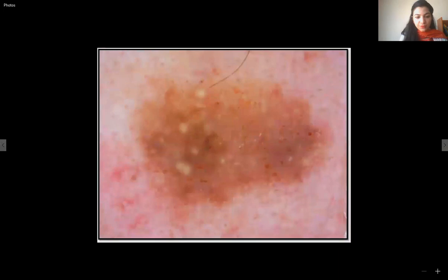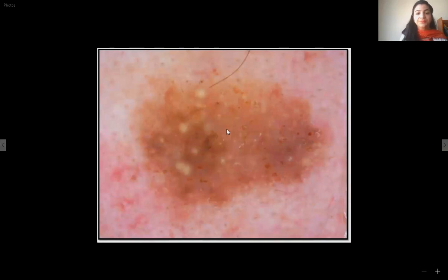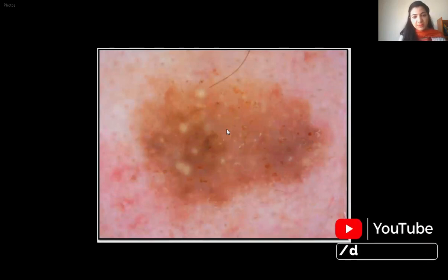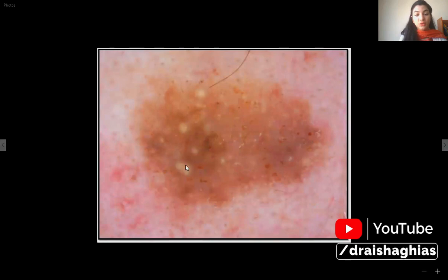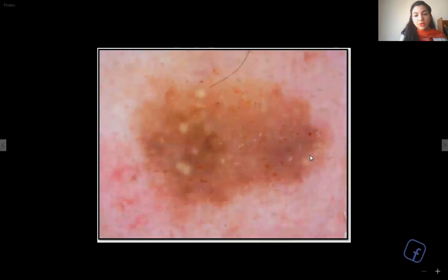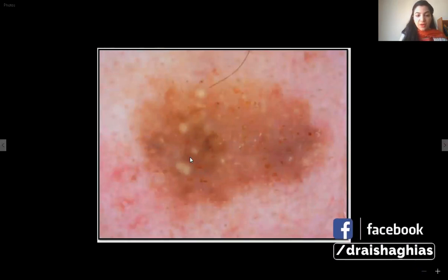Going towards the fourth image: this is pretty simple. As discussed with the first image, there are comedo-like openings and a well-circumscribed lesion. There is a little bit of color variation but it's not significant, as there are no blue-gray dots and clods or any isolated structureless areas. The comedo-like cysts are also very prominent. Two features of seborrheic keratosis are prominent here: comedo-like openings and milia-like cysts. So this lesion qualifies as seborrheic keratosis.